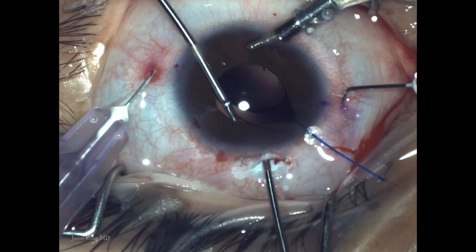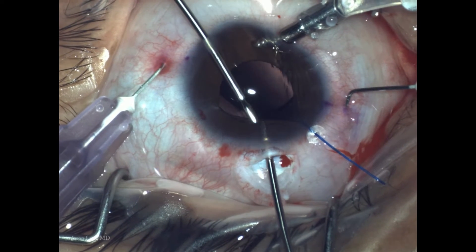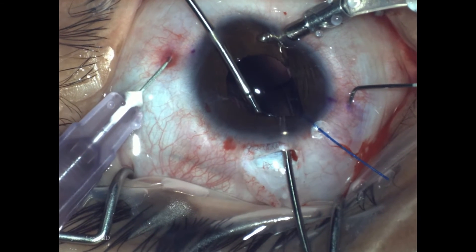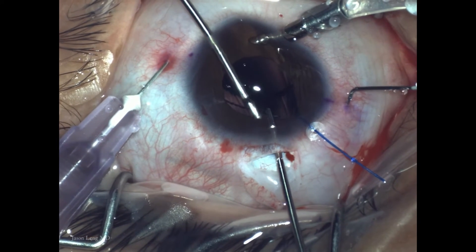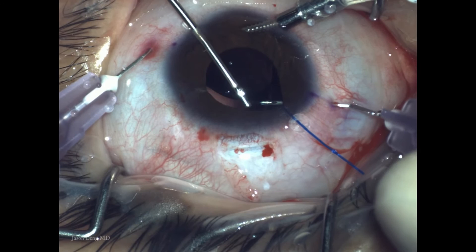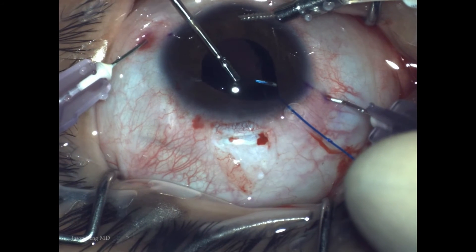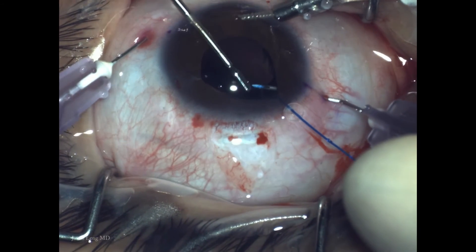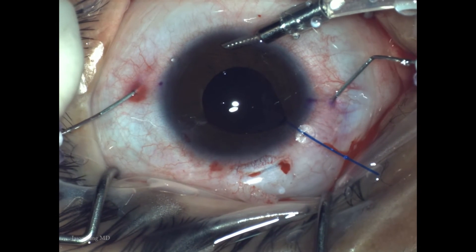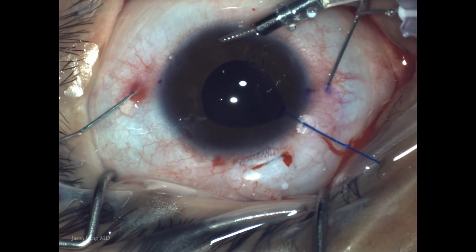Next I use a handshake-like technique to get good control of the trailing haptic, going about 3mm from the tip for good control. It's very important to check that the haptic of your three-piece lens fits in the needle lumen — some lenses like the AR40e have thicker haptics and require a 27-gauge needle. I prefer the 30-gauge because it's less traumatic and gives a snugger fit.